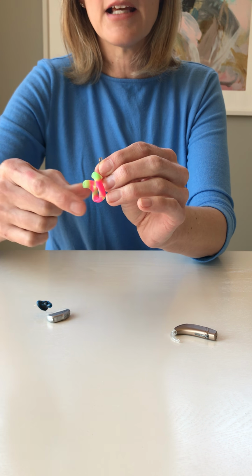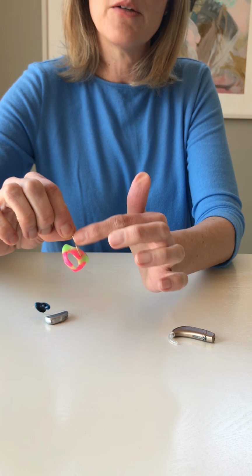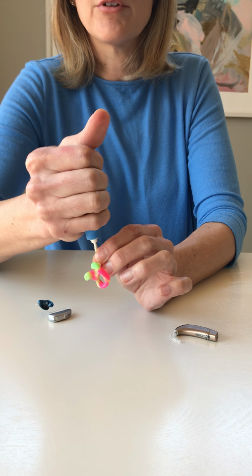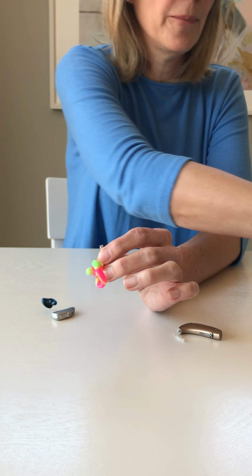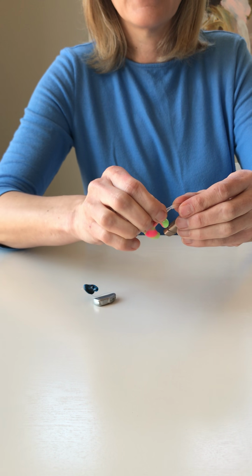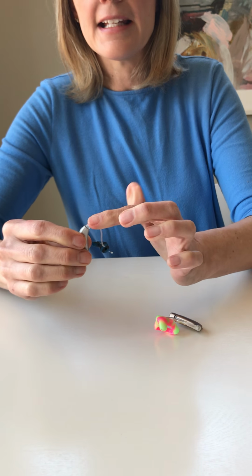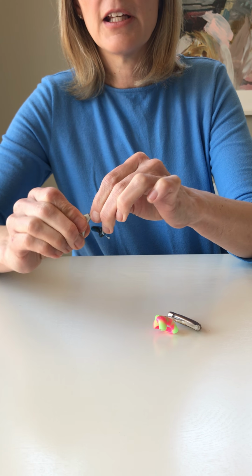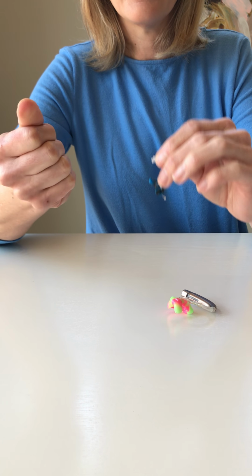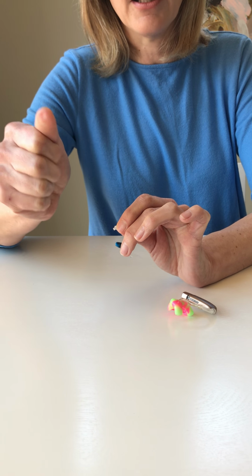Once I see water is able to shoot out, then I'm either going to let it dry on my counter for a couple hours until I don't see any moisture in here, or if I have a blower, I can blow any remaining moisture out of my ear mold. Once that's done, I should be able to attach these two pieces again, and my hearing aid should be working beautifully. Likewise, if I had a slim tube mold and I was getting no sound, if I unscrew the slim tube from the hearing aid and I hear the hearing aid working, then I know the problem is with this part. If I don't hear the hearing aid working, I need to call my audiologist.